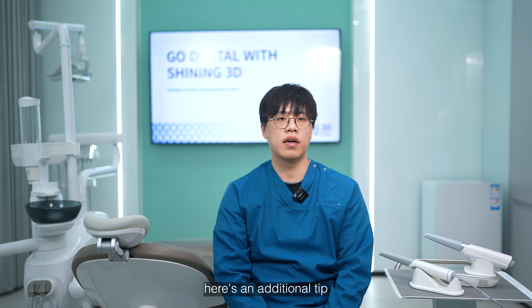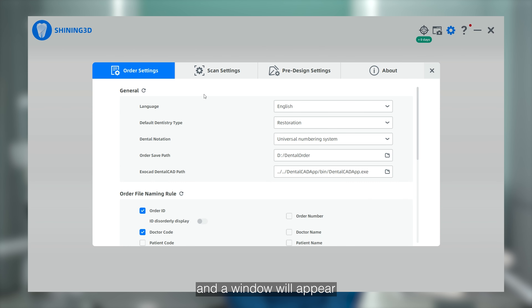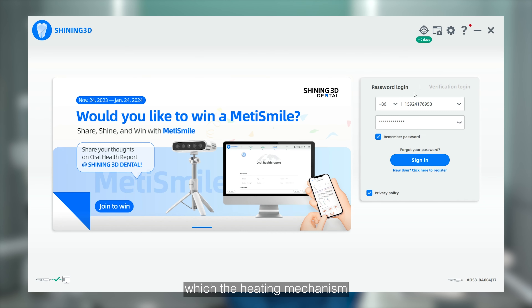For the AuraScan3, there is an additional tip for different room temperatures. Click on Settings in the upper right corner and a window will appear. Select Scanning Settings, locate the scanner tips heating option, and you will find three choices: low, medium, and high. The difference among them lies in the target temperature the heating mechanism should warm the scanner tip up to.